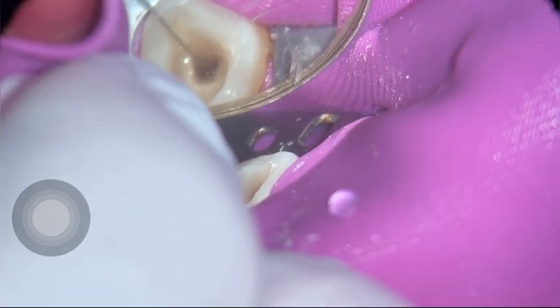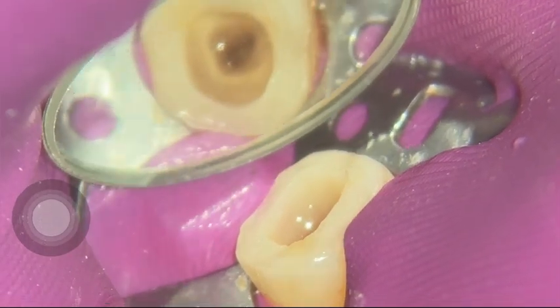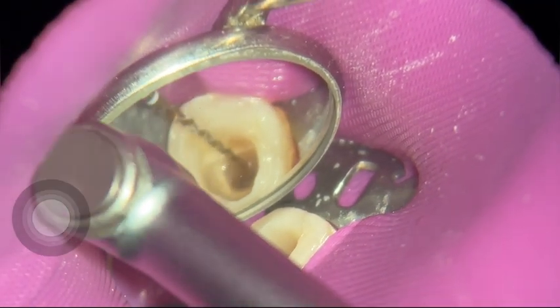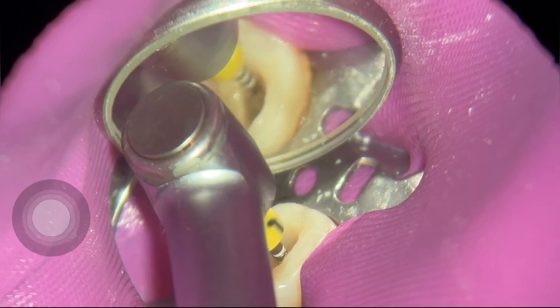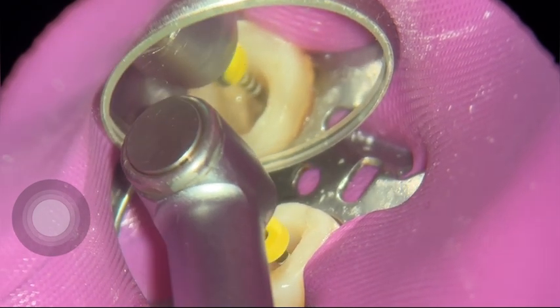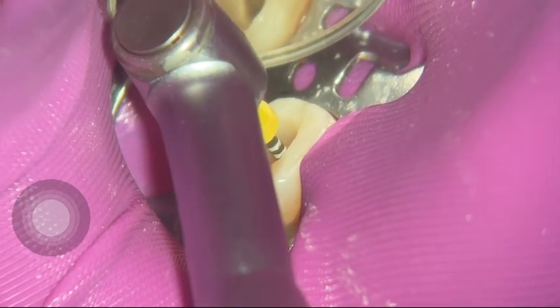I'm going to measure my working length. I haven't included all the steps in this video just so I don't make it boring. I find my working length and then I use my ProTaper Gold sequence to enlarge these canals — going SX, S1, S2, and now I'm showing you my last instrument, which is the F1. I show that it goes to length with three strokes on each canal.